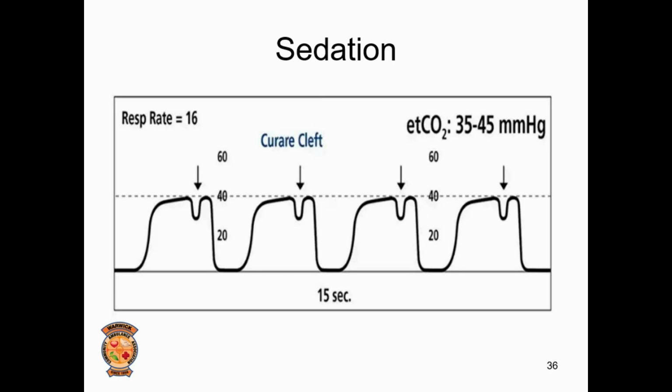It's the patient trying to take a breath, but they're still sedated enough that they can't take a full breath. If the patient's going to remain sedated, this is the time where you need to add additional sedation, or if your goal is to remove the sedation and extubate the patient, this is a good indicator that that time is coming soon.